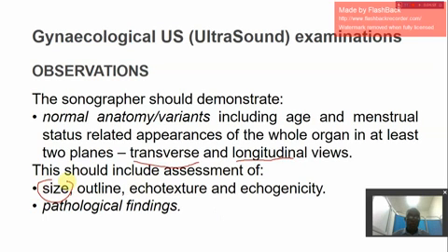So you are going to look at the size of the uterus, of the ovary, the outline of it. Is there any lobulation, echotexture of the organ, and also other textures, hypoechoic, anechoic, whether it's hypoechoic or anechoic.